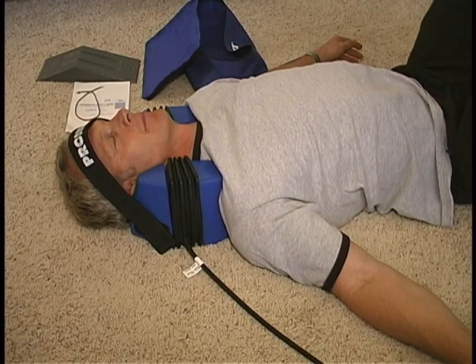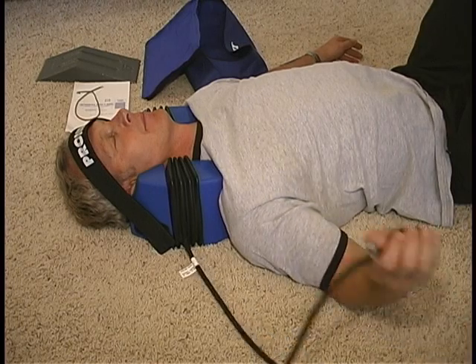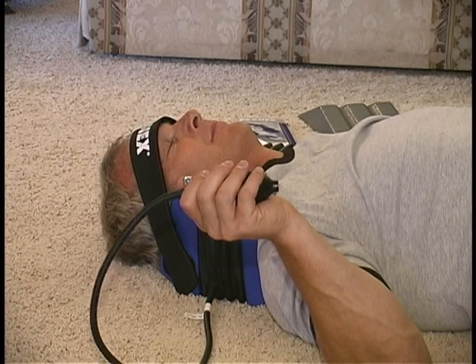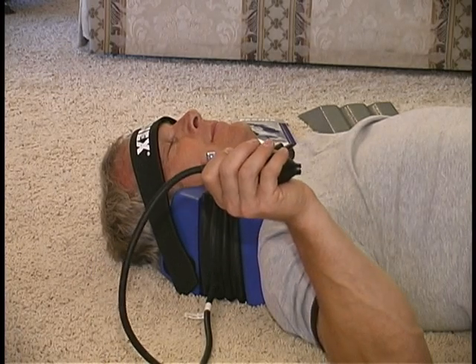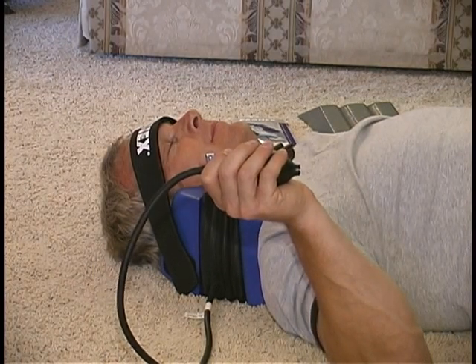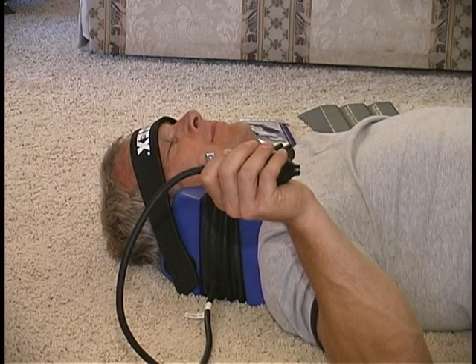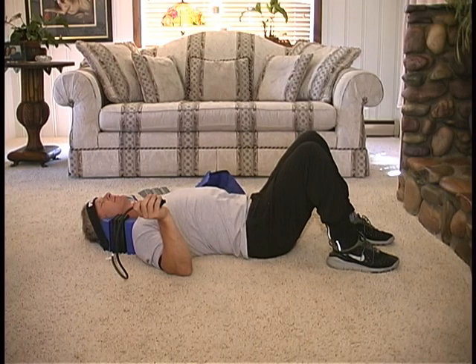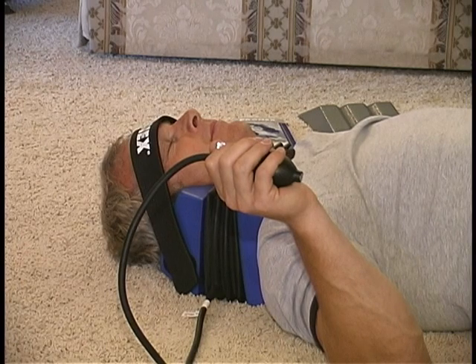At any time, PRONEX can be deflated and you can readjust your positioning. Continue with your traction session for the amount of time prescribed by your doctor. A typical session lasts between 10 to 20 minutes. After you are finished, release the chrome valve counterclockwise and let the air fully deflate from PRONEX. This allows your neck and head to readjust to avoid head rushes or uncomfortable dizziness.